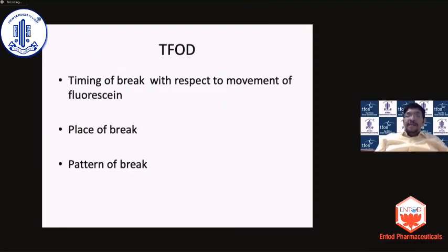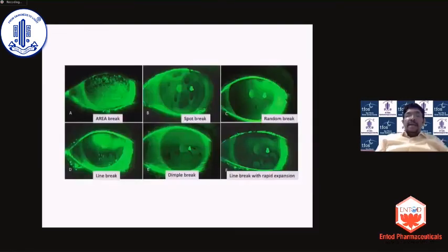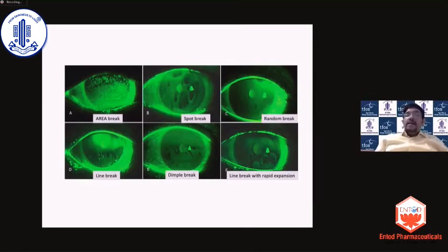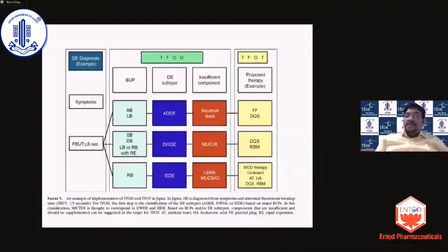The TFOD classification discusses the timing, place, and pattern of the fluorescein break. Figures A and D represent what you would see in aqueous deficiency dry eye. A spot break or dimple break is seen in patients with decreased wettability — even as the tear film moves up during a blink, it doesn't completely coat the surface. A random break of the tear film after formation indicates evaporative dry eye. This classification has treatment implications: aqueous deficiency requires tear supplementation; decreased wettability suggests a mucin-16 issue addressable with rebamipide or diquafosol; evaporative dry eye requires lipid layer replacement.